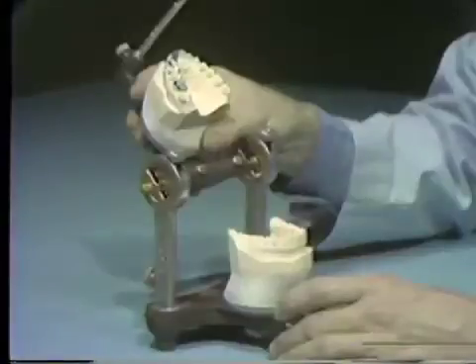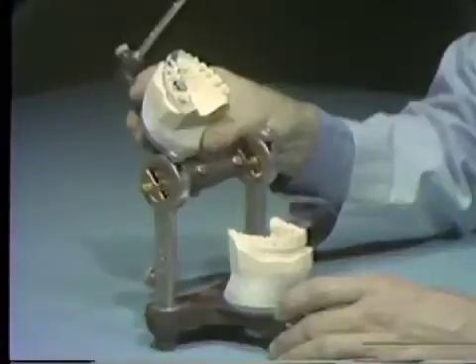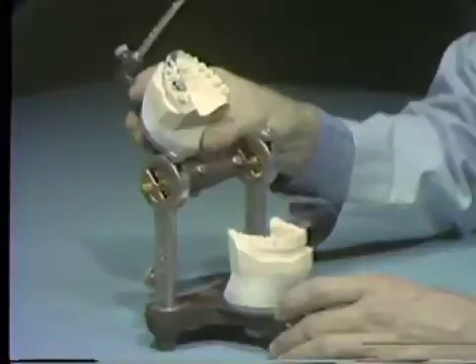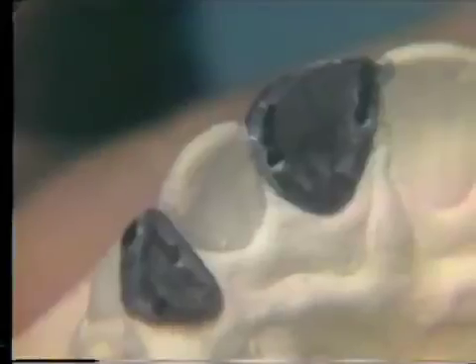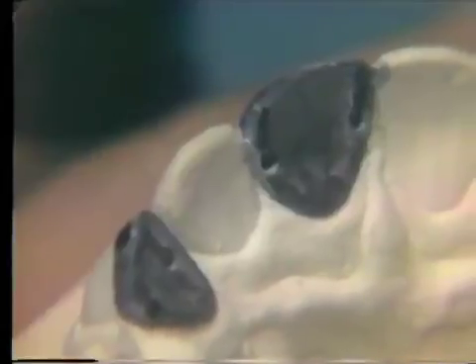Before checking CR contacts, review the functional contacts on the molar, cuspid, and central incisor. The position of the centric stops and non-supporting cusp contacts should be noted.